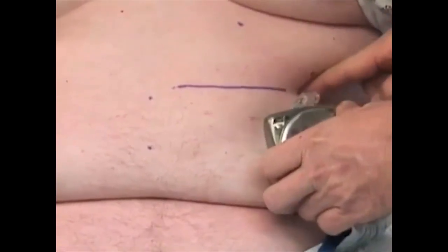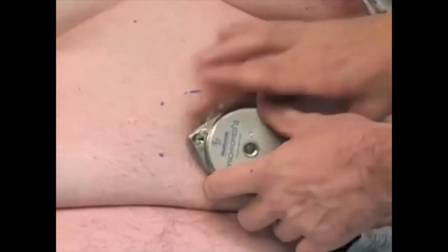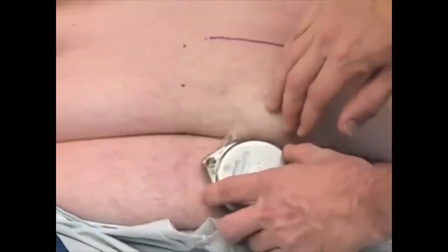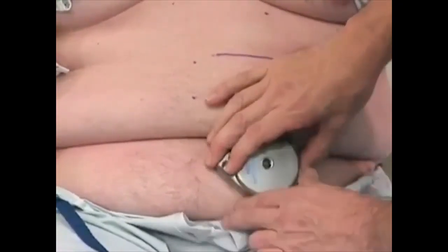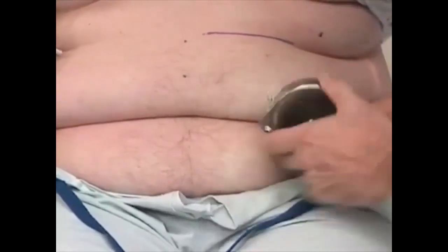The same thing, it is very important not to let this rub against the ribs. So again, head towards the medial, angle it, and then the upper port. Again, down in here, there would have been a real problem had we made the incision here, because it's now in a skin crease that would not heal very well. And in this area, the pump has rotated.